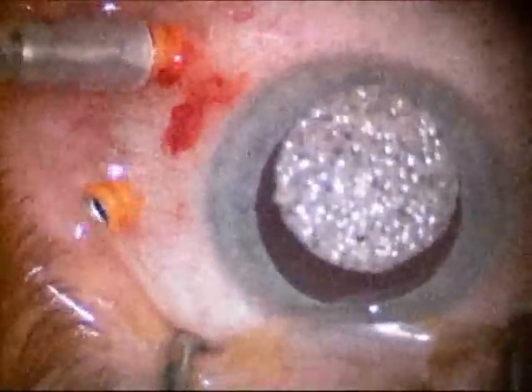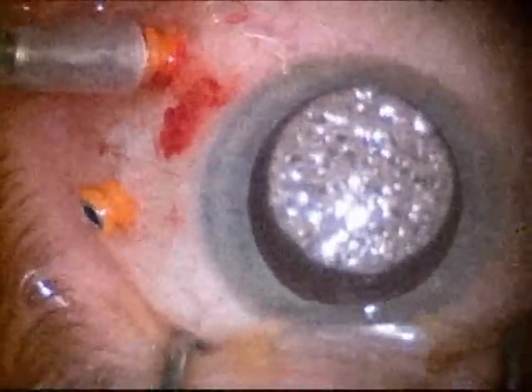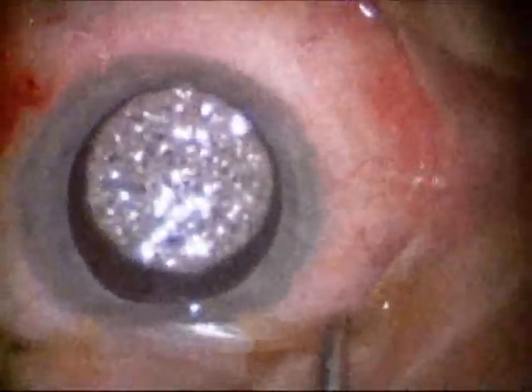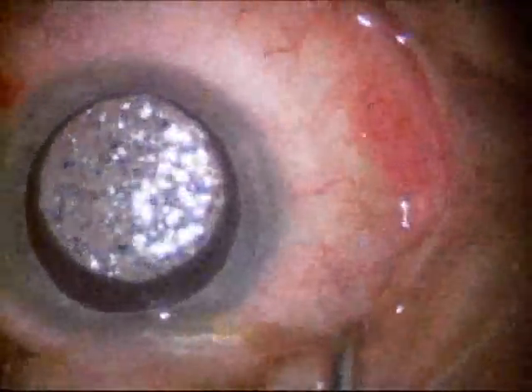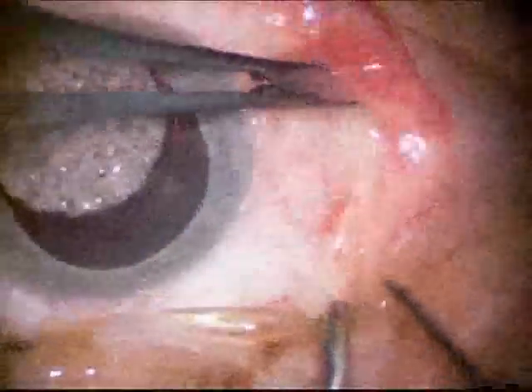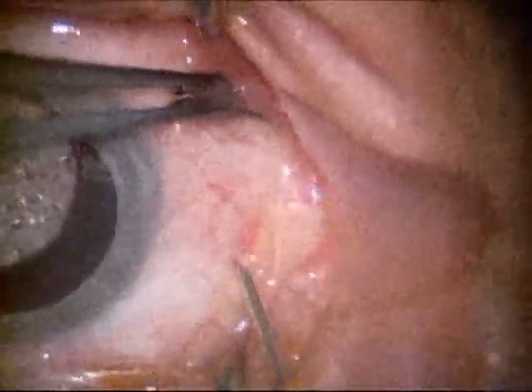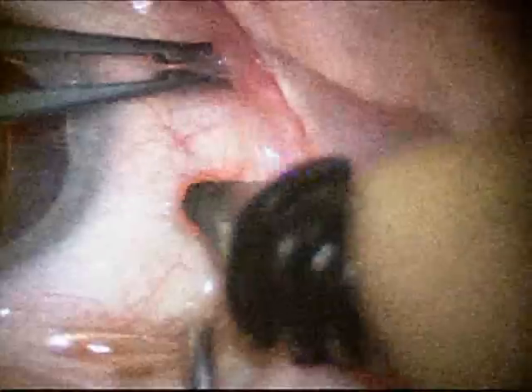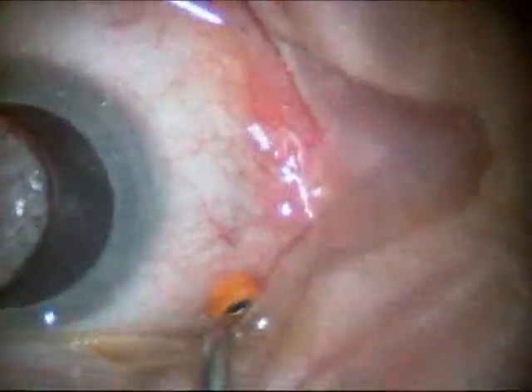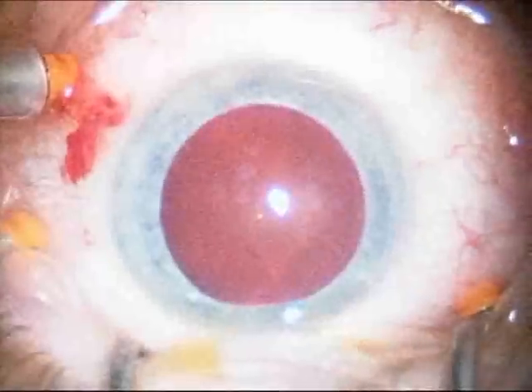This case is being done under anesthesia. The patient is awake but the eye has been anesthetized prior to the surgery. There you see another port being placed, and finally the third port will be placed on the other side of the eye. This allows complete access to the inside of the eye for the various maneuvers necessary to affect closure of the macular hole. The small white sponge in the center of the cornea is used to protect the cornea from the microscope light.